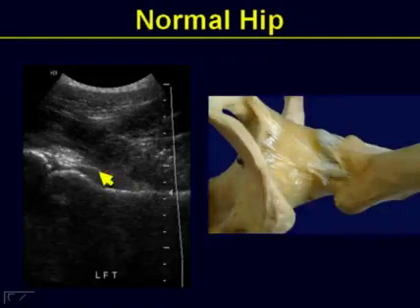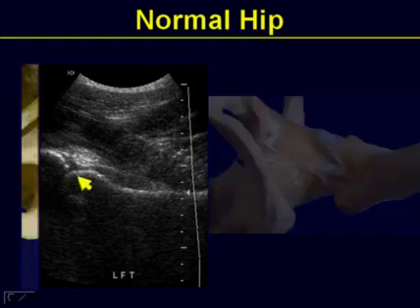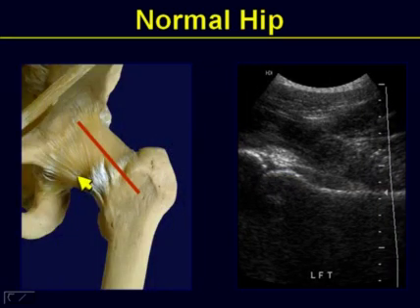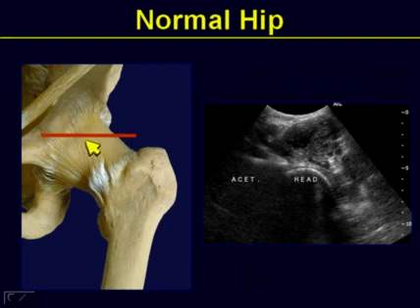And if you look at the normal hip in the long axis view, you're now familiar with the skyline pattern or the silhouette in this profile. But it is not until you look at it also on short axis view. So you're now familiar with the hip in long axis view, and now we turn the probe 90 degrees to look at it in its orthogonal plane.